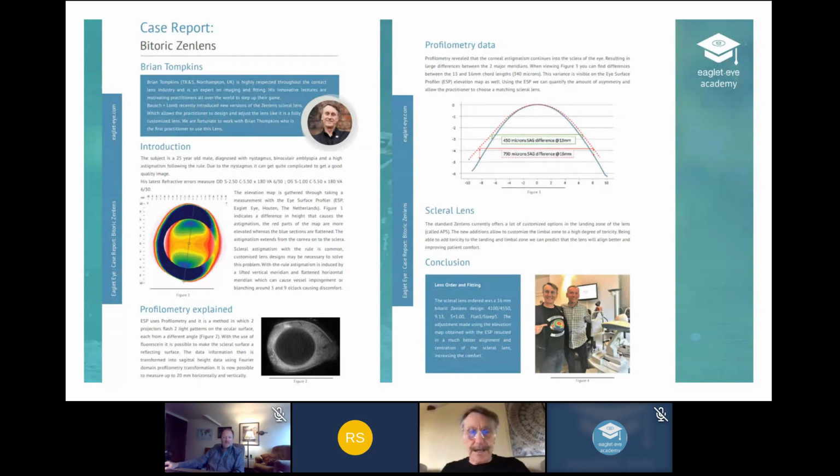Sean is one of our long-standing patients. He's got nystagmus, so his best vision is about 6/36 in English language. Americans and others will have to translate to something, but it's not particularly brilliant. So he's well within incapable of driving, etc., etc. But he manages to function.